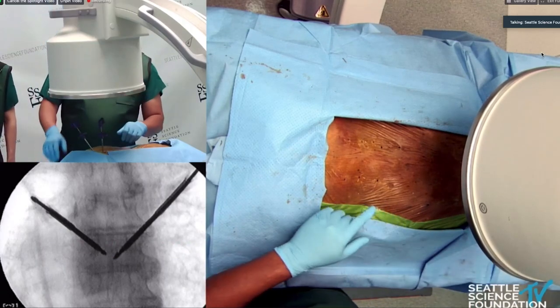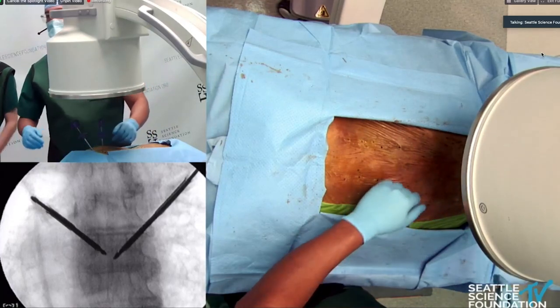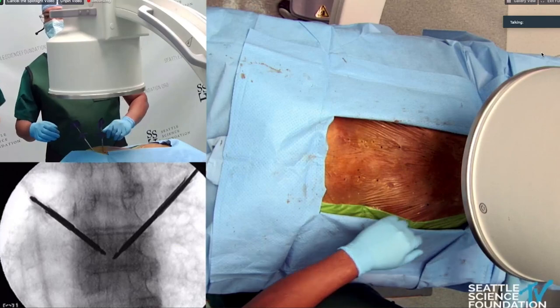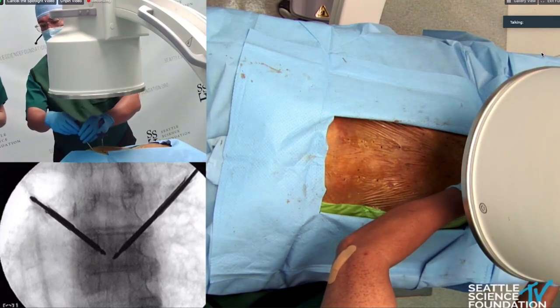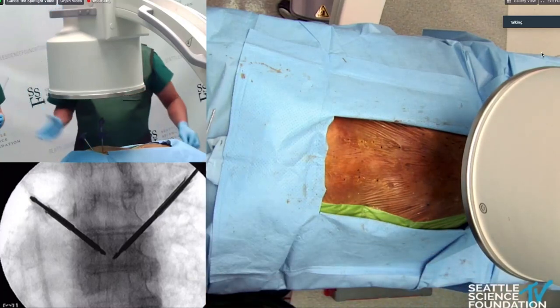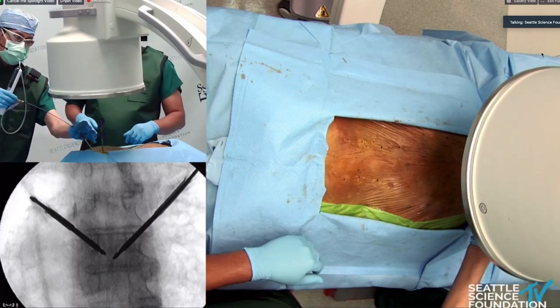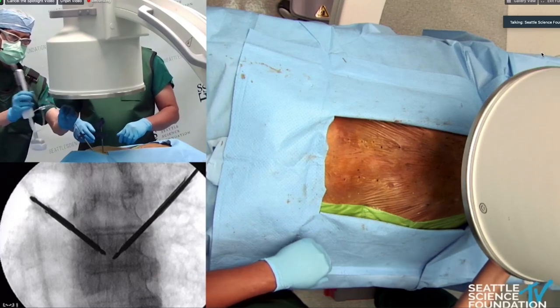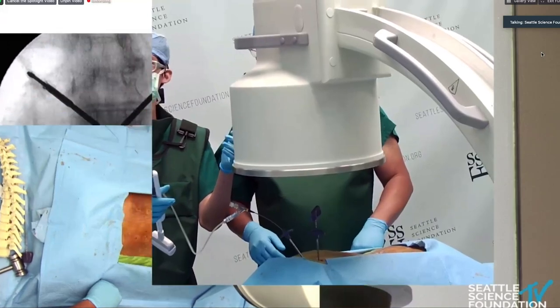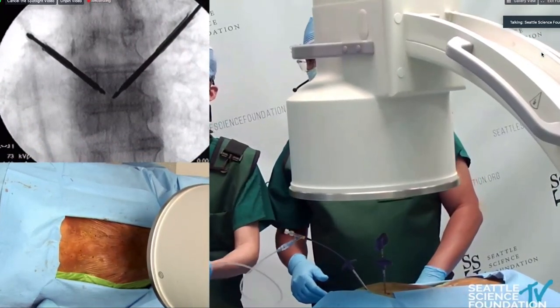Right now we're mixing the cement and we're going to change over to the balloons. My fellow James Ying, an interventional spine fellow, will implement the balloon. This balloon is a PMMA-resistant balloon; it also goes up to 700 psi.